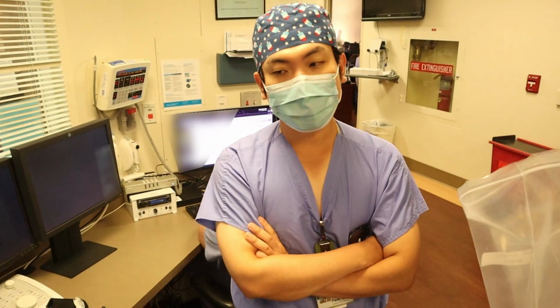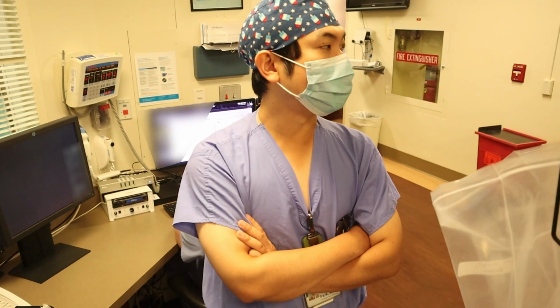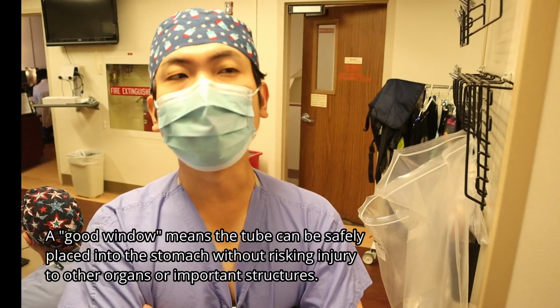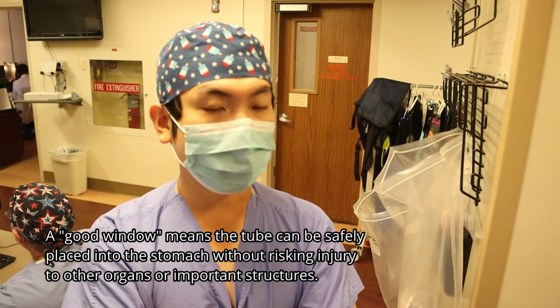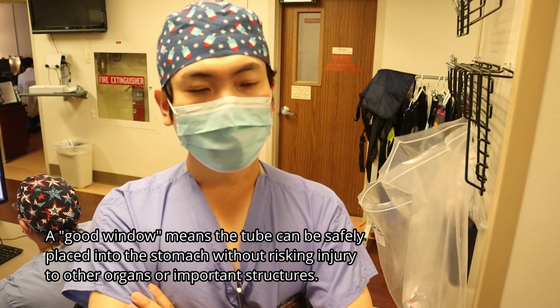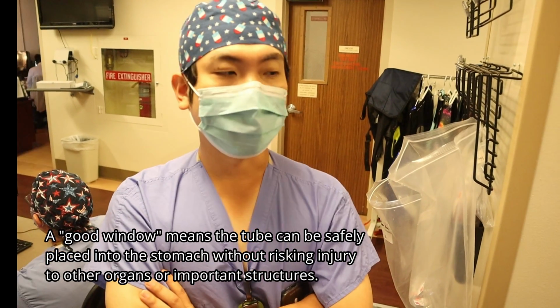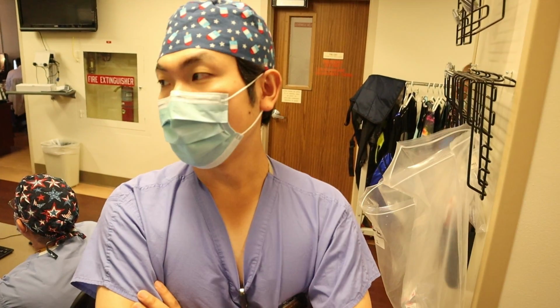Thankfully for this patient we had cross-sectional imaging available for review, which we reviewed during morning rounds. The CT showed a really good window to the stomach without any intervening overlying colon or liver. But we'll double check again with ultrasound and fluoroscopy just to be sure that this is a safe window. So it should be a good case.